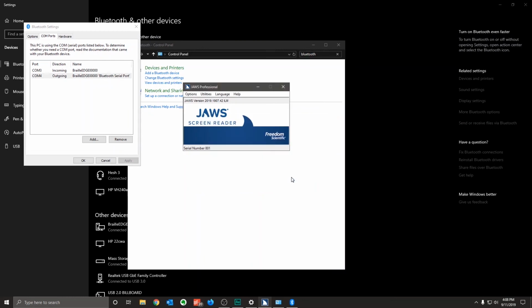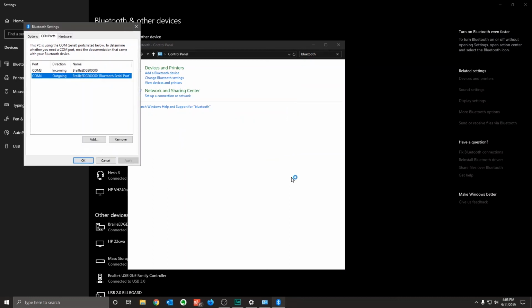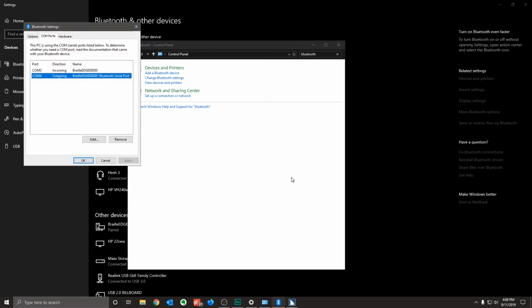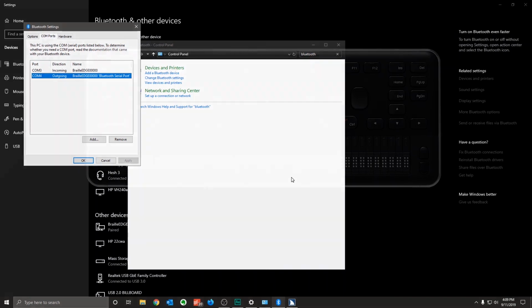And now with JAWS, I'm going to press Alt and F4 to close that. Now that JAWS is closed, I'm going to reopen JAWS by pressing the Windows key and typing JAWS, then pressing Enter. And now that JAWS is open, your QBraille should be connected just fine.